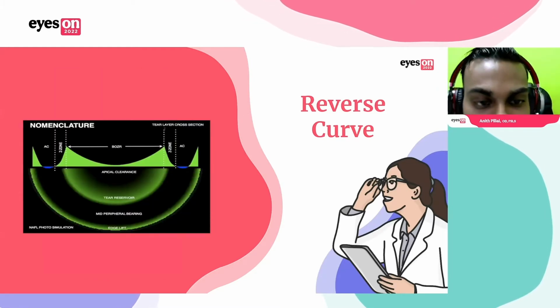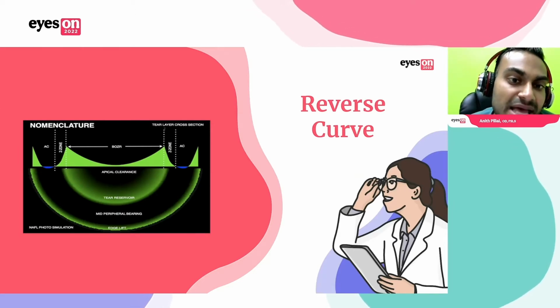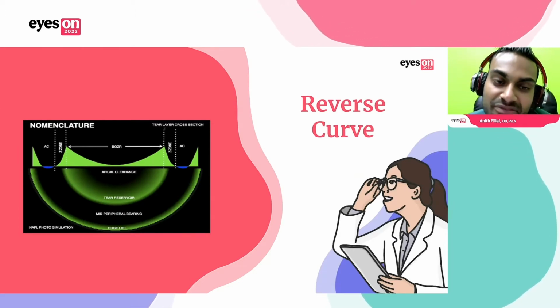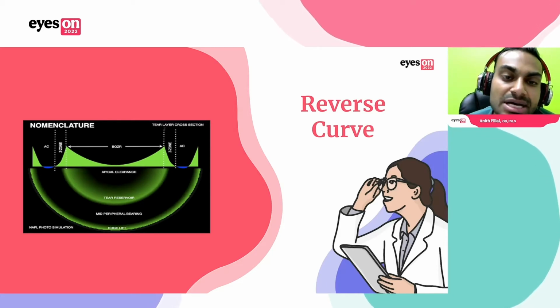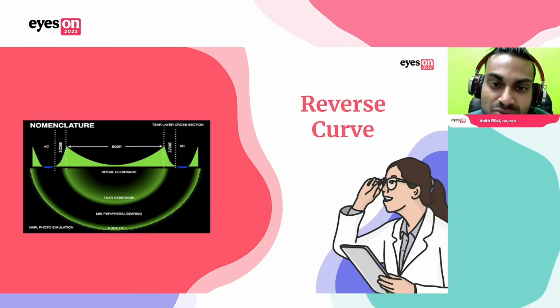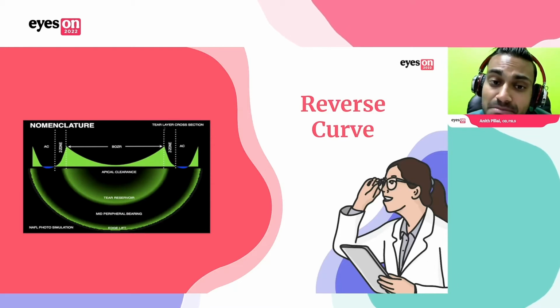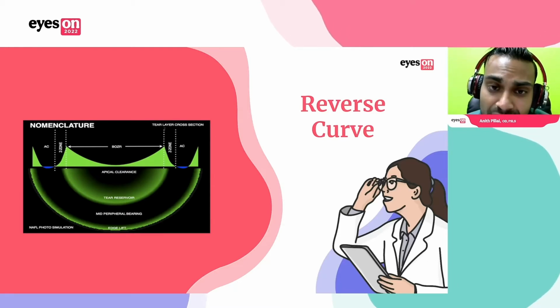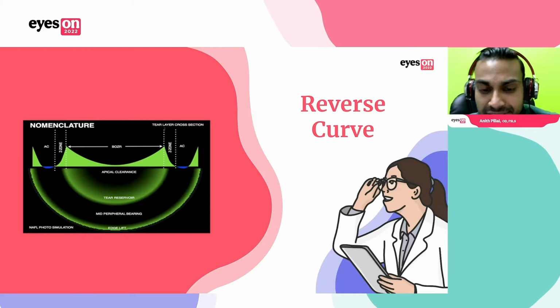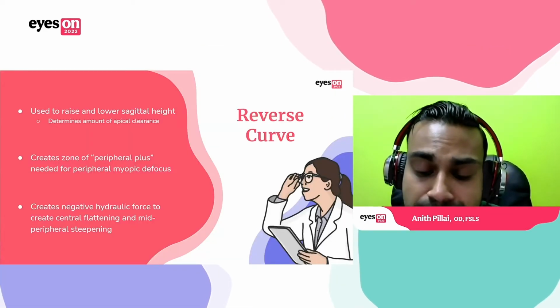And here's the tear layer depiction again. So again, the base curve right in the middle with that tear film. And then you see this ramping up of a lot of fluid layer underneath the Ortho-K retainer. The reverse curve is typically the steepest area of the design. This is where the negative pull force is happening. And it's also where that mid-peripheral steepening is going to occur on your topographical analysis. And I like to say this is where the magic happens in Ortho-K.